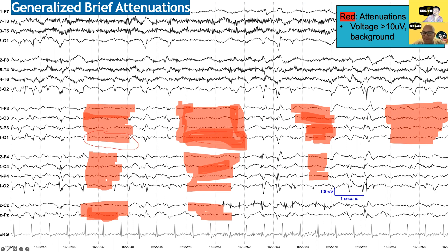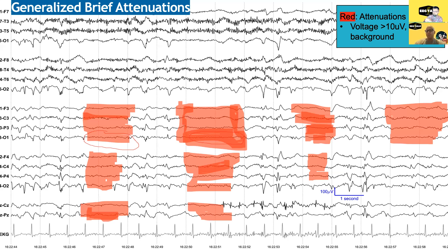When we see GPDs or discharges in the background, it's easy to overlook the more subtle findings, but it's important to describe them both. This suggests additional problems — it could be a drug effect, where someone is giving the patient medication to make these things go away, or the brain is getting quite exhausted. These could be a sign of a metabolic crisis of some kind, where it can't keep up the discharges all the time.